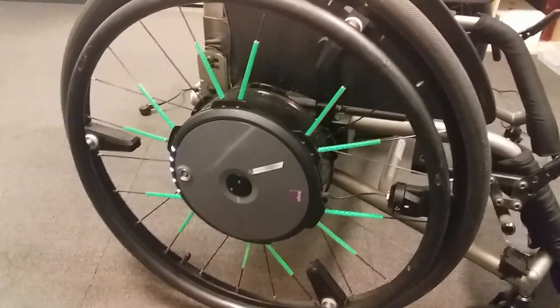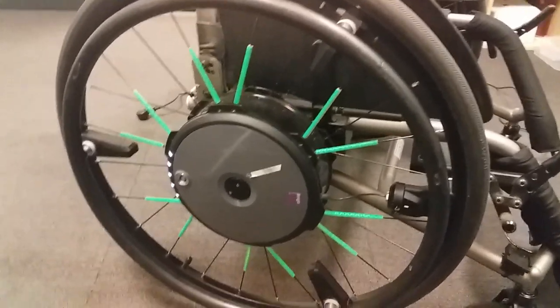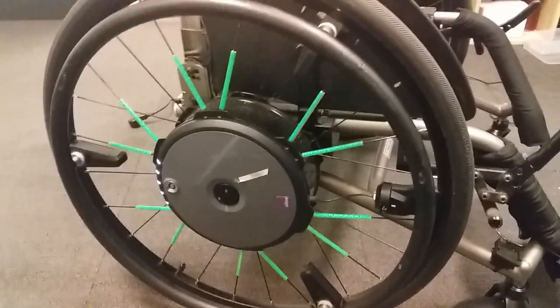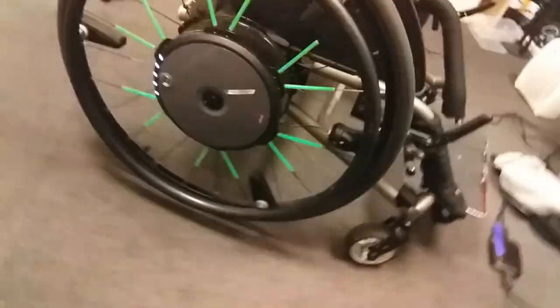This chair is really fancy. It has a remote control function where I can control the wheelchair from my phone, but because I'm recording it isn't going to work. I just worked that out in my head.